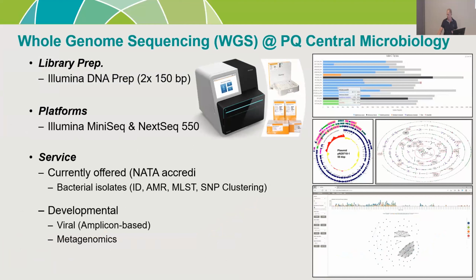So we're growing up the organisms, but doing really good identification, so we're absolutely certain about what organism we're dealing with, characterizing the antimicrobial resistance genes, and then doing this high level, fine genotyping to look for outbreak clusters.